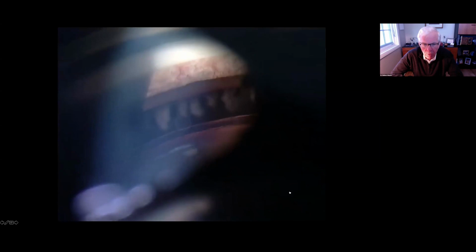This is somebody with neovascularization of the iris and angle, and it's pulled the iris up and out, and that allows you to see the ciliary processes there. But I would say anytime you put on a gonio lens and you see the ciliary body, you should be wondering why and what's wrong that's causing you to have this view. If you have a big round lens like in spherophakia, sometimes that will let you see the ciliary body, but in a normal eye, you won't see it.